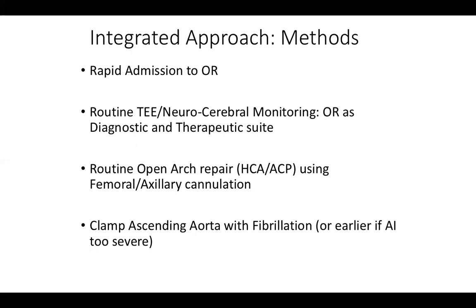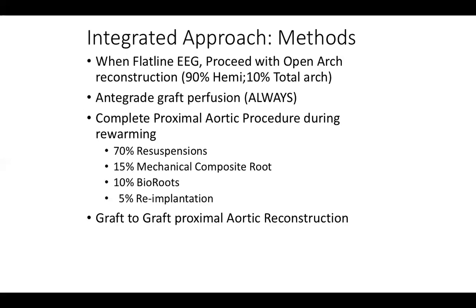So an integrated approach to managing this includes rapid admission to the hospital, to your center, to the operating room. Neuromonitoring is absolutely key. Stroke can be common. Open arch repair, and I'll get to this in more detail shortly, utilizing antegrade cerebral perfusion and axillary, plus or minus femoral, cannulation.